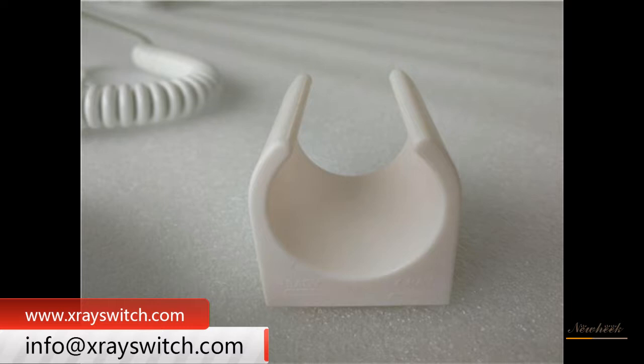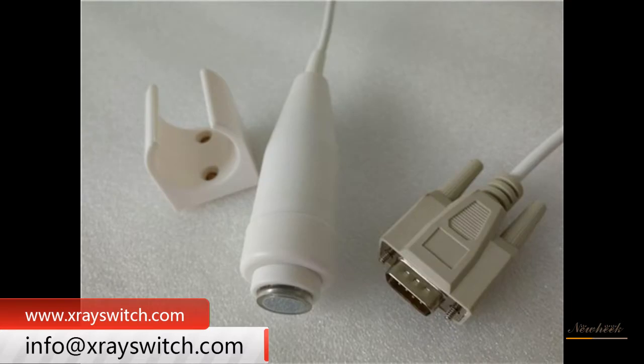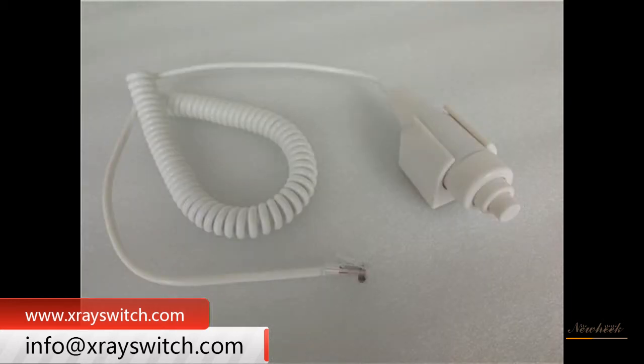The 2-gear X-ray hand switch has 2 gears. The 1st gear is connected when pressing the 1st gear, and the 2nd gear is connected when pressing the 2nd gear. Both 1st and 2nd gear return to disconnection when released.